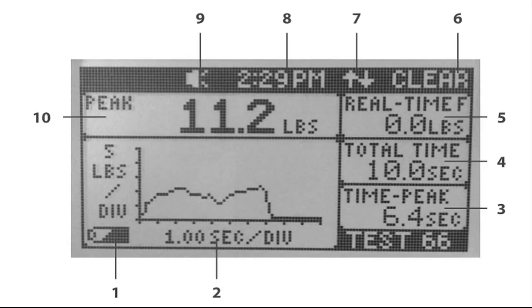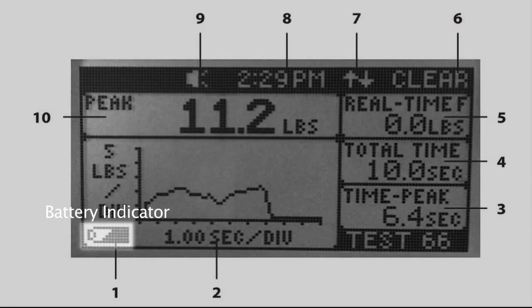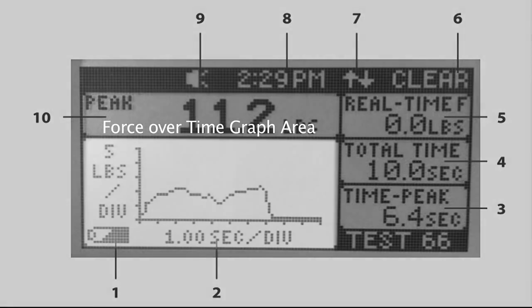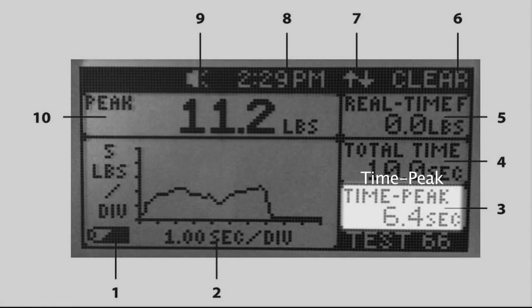The main measurement screen shows all measurement information being captured and is displayed whenever a measurement is in progress. Item one is the battery indicator, which shows the remaining capacity and charge of the battery. Item two is the force over time graph area. The graph displays data for the previously conducted test and automatically populates the chart to maximize the viewing area. The y-axis shows force in pounds, kilograms, or newtons, and the x-axis shows time in seconds. Item three is time to peak — the elapsed time in seconds from the start of the test until maximum force has been reached.